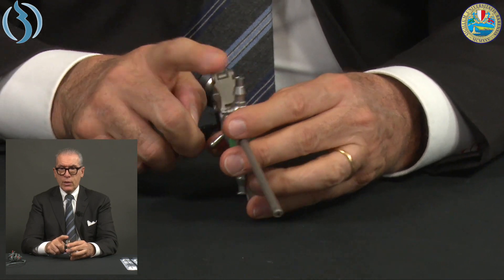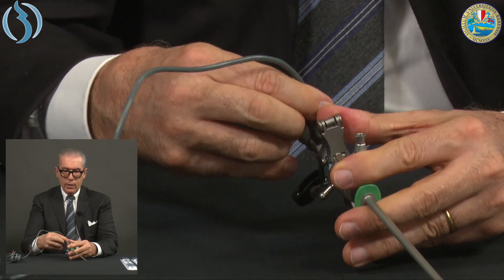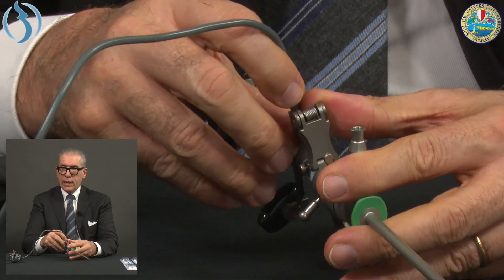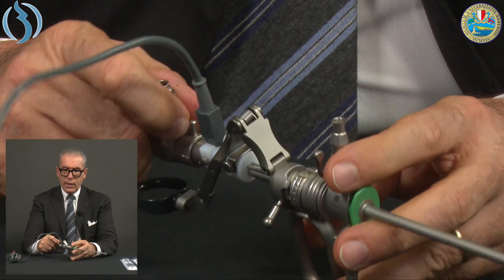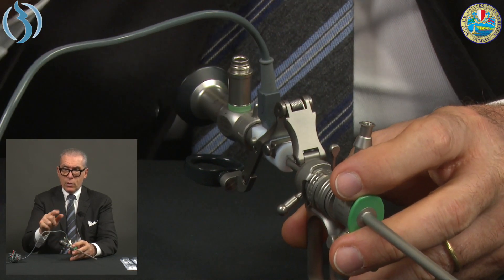Once the system is locked, connect all the tubes: irrigation, aspiration, and the electrical cable. One difference from the classic resectoscope is that in the mini, the electrical connection is on the top rather than below. The light cable also connects on top, so the light cable, electrical cord, and irrigation will all be above the patient's leg, while aspiration goes below.